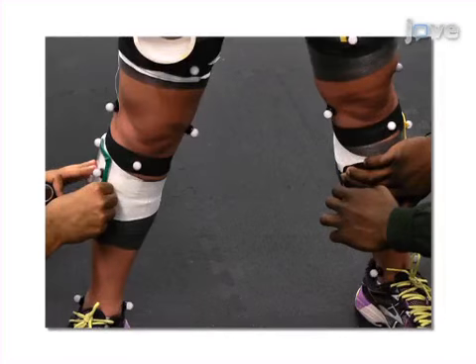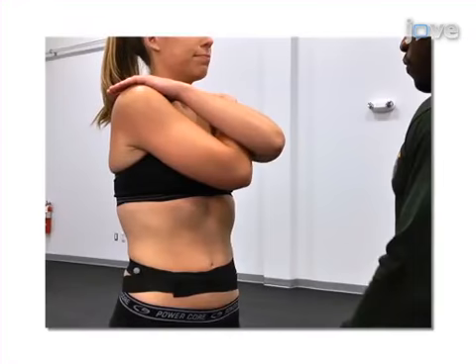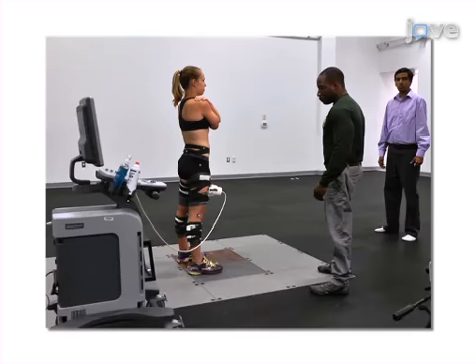This is accomplished by first preparing the subject by placing reflective markers on the subject's lower limbs and the transducer on the subject's thigh. Next, the subject is asked to stand with arms across the chest in the middle of the motion capture volume, and a static trial is captured.